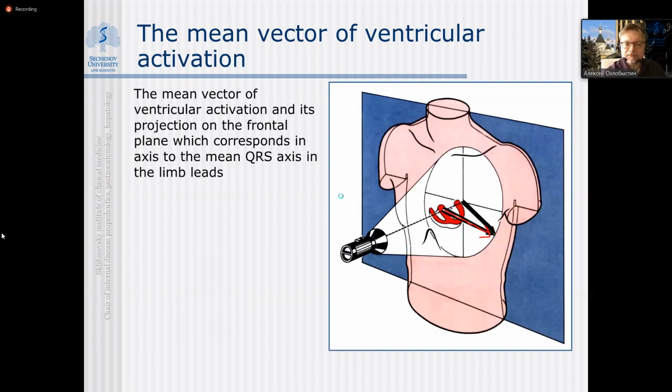What we record is like a task you may have had in secondary school when studying geometry. You are given the projections of an unknown vector to the x and y axes, and what we have to reconstruct is the location of the vector.